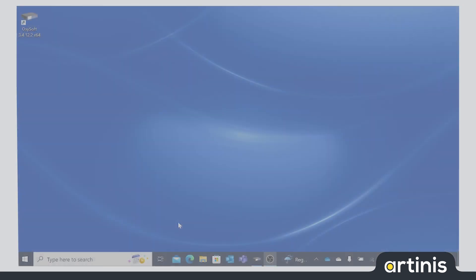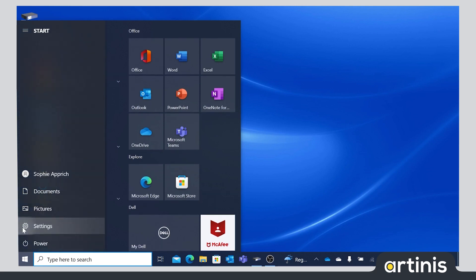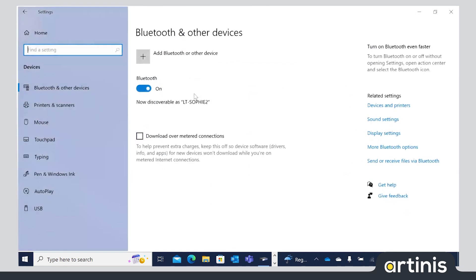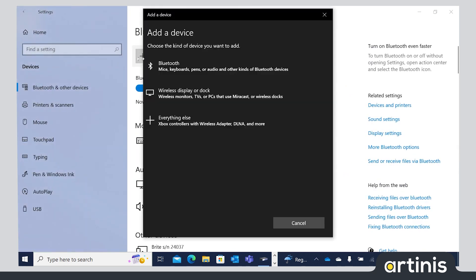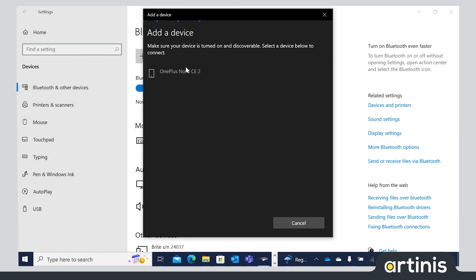To connect the device to your computer, go to Settings, Devices, Bluetooth and other devices. Click here on Add Bluetooth or other devices and Bluetooth. The device you would like to add to your computer should now show up.